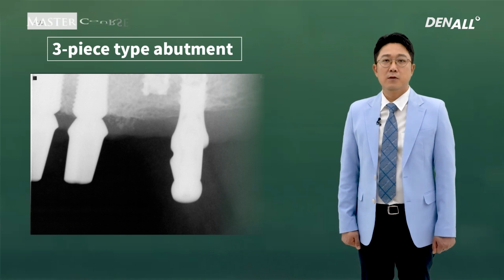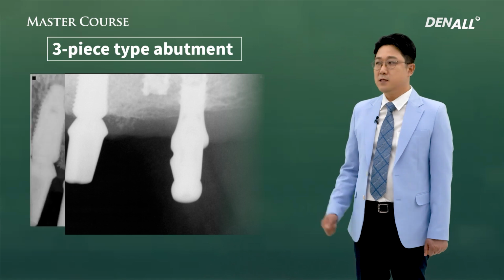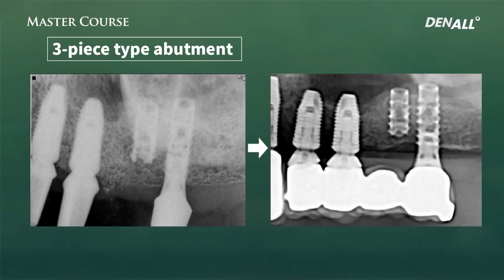Abutment was fabricated in this way, and I checked once again whether the abutment was well adapted using the X-ray image. After I checked, I connected with the mesial implant and created the final prosthesis.